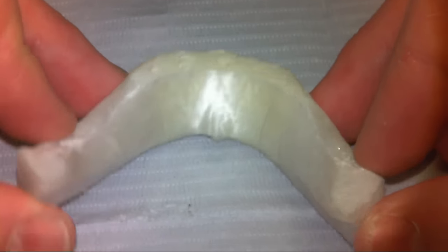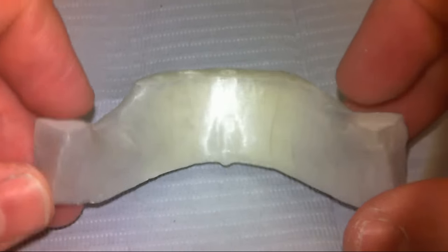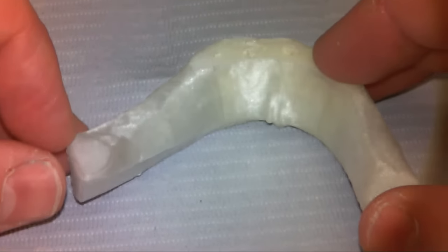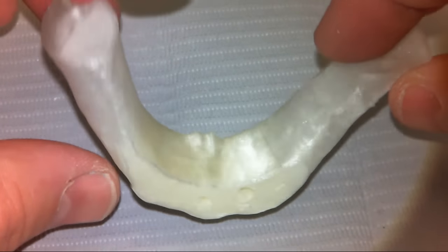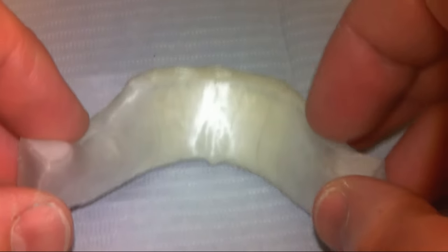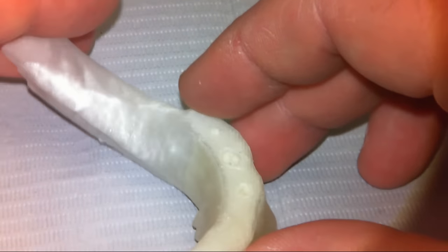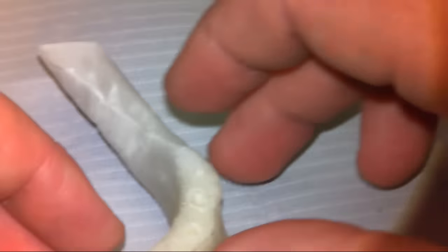Hey everyone, this is Dr. Corey Glenn. I'm going to be demonstrating today the new Blue Sky Bio fully guided kit. If you've used their products in the past, you know that to this point we've been doing the single-cut drills, which are awesome and extremely cost effective. The only thing was that you couldn't guide the implant on a fully guided carrier all the way through the stent, so this new fully guided kit enables us to do that and gives us a lot more flexibility in the drilling protocol.